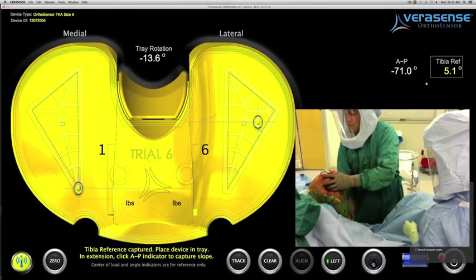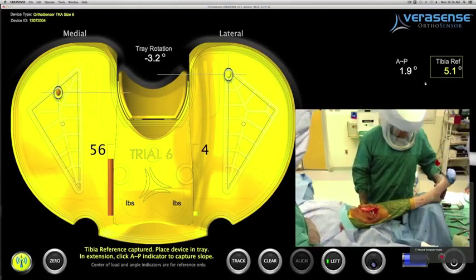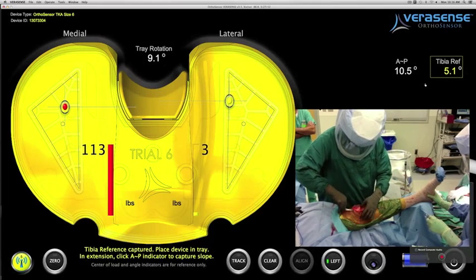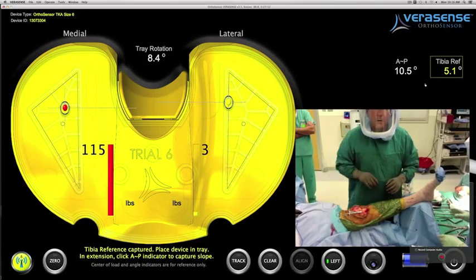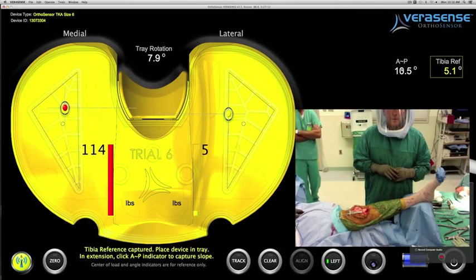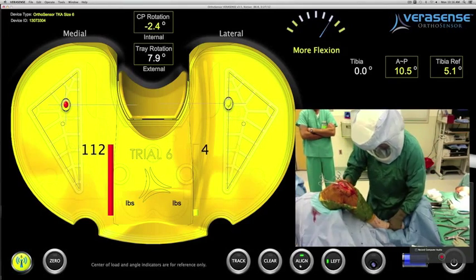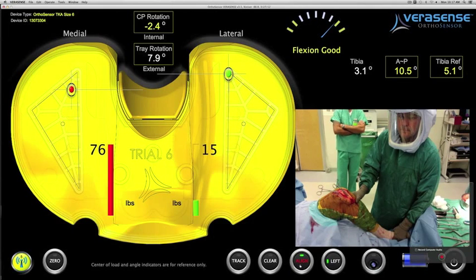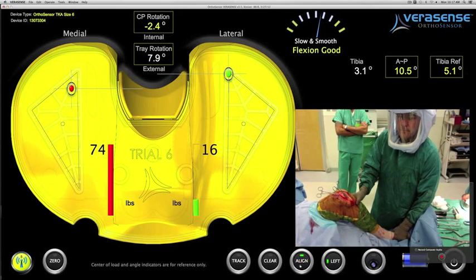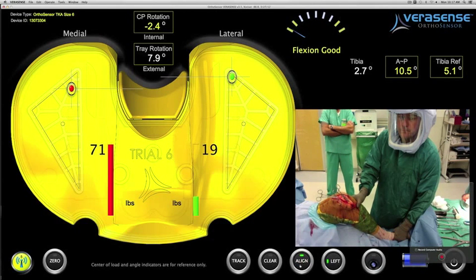The surgeon takes the tibial crest as a reference point to correlate his posterior slope. He takes the knee into extension and closes the medial capsule. After defining that his rotation is appropriate, he sees in extension significant medial compartment tension. His slope to the tibial crest on the AP box in the upper right-hand corner is 10.5. He then takes the knee into flexion and shows significant medial loads compared to the lateral side as well.